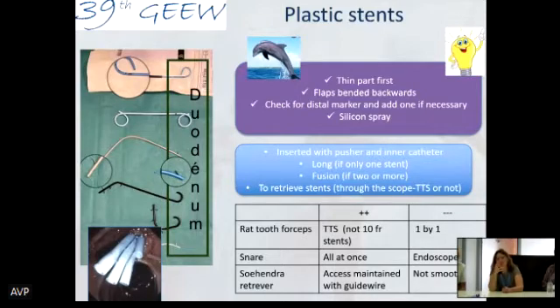We use a lot of this silicone spray that the anesthesiologists use to intubate. If you want to put multiple stents side by side, we can also put a bit on the stent before putting it in. The problem is that everything slips afterwards, so you shouldn't put it on the floor. And it makes it a bit more rigid, like when you use it on the endotracheal tube, you have the same effect. So it makes it a bit more rigid, and also more smooth. So you can put them side by side in an easier fashion.